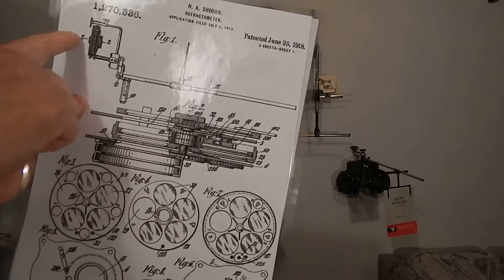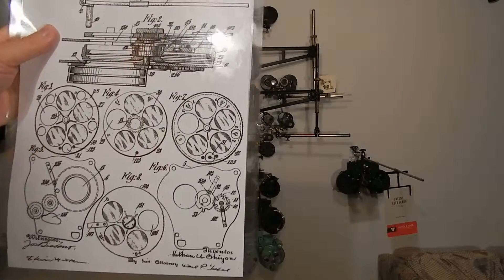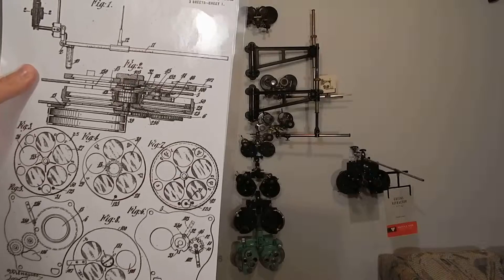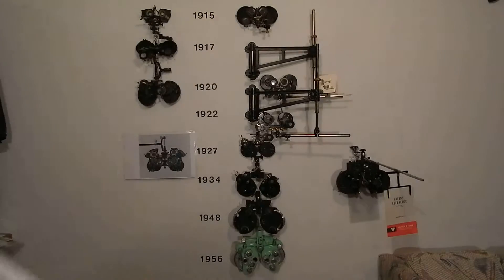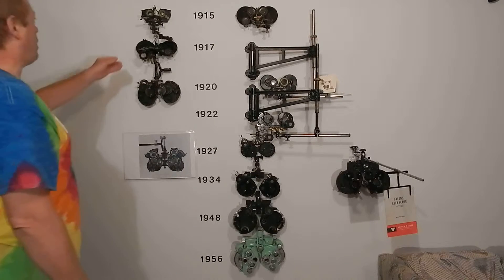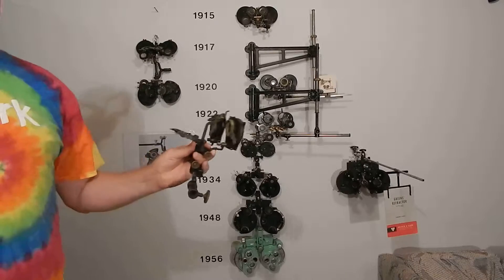Now it's binocular — you've got two eyes. There's a near point chart. This is possibly the first phoropter. A patent in 1915. He's from New York City, from the Bronx. He had it made by William Reimold in Philadelphia.